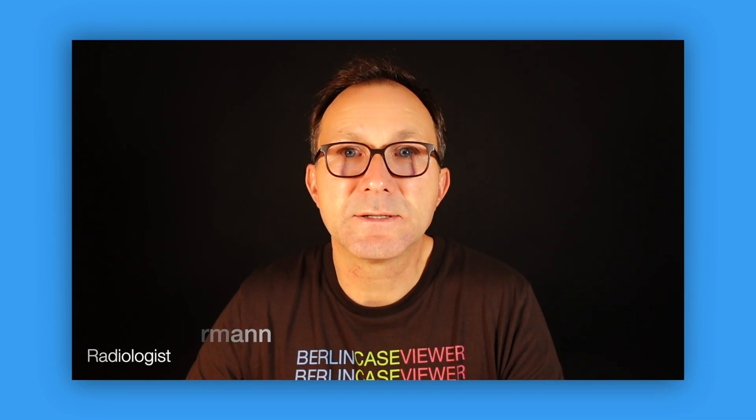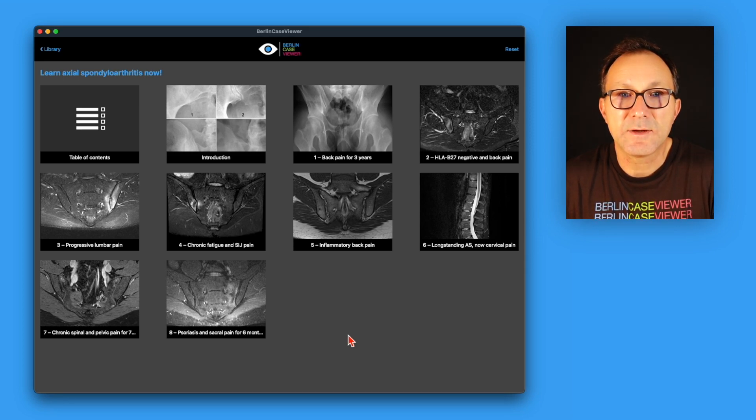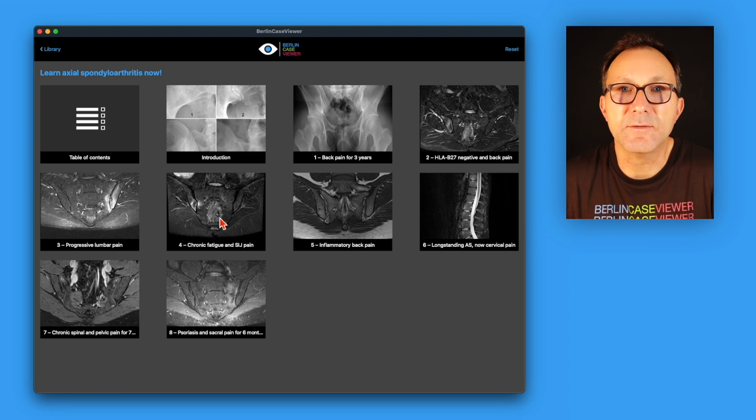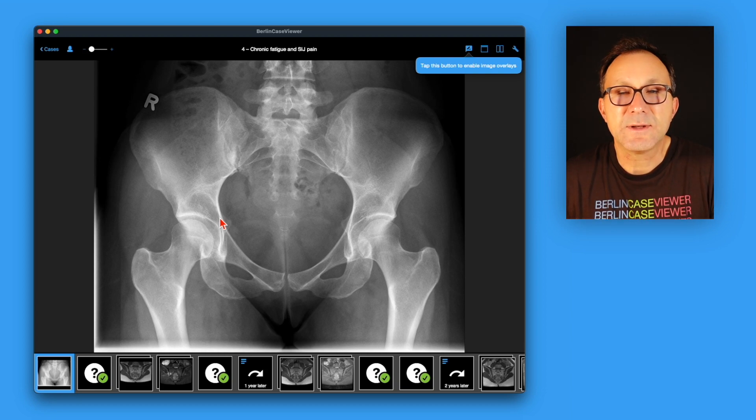How is the course of axial spondyloarthritis as seen on MRI? I'm Kai Herrmann, a radiologist from Berlin specialized in musculoskeletal diseases. Today I'm going to show you case number 4 from the module 'Learn axial spondyloarthritis now' in the Berlin Case View App. Here you can see an overview of these 8 cases along with an introduction, and case 4 is very interesting as it reveals the course of the disease. So let's dive into this case.